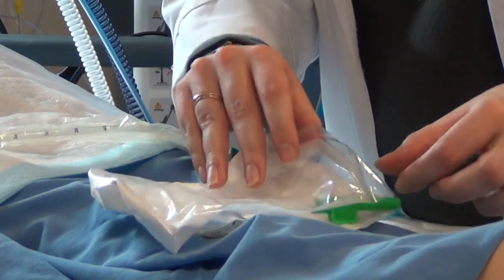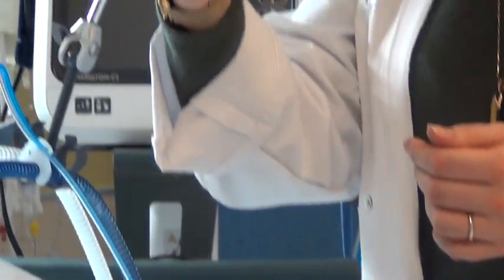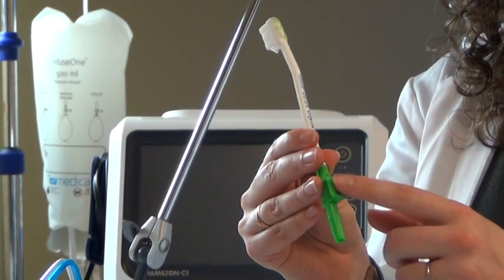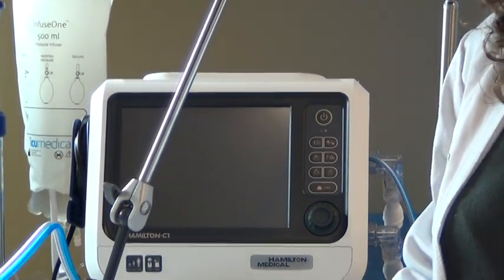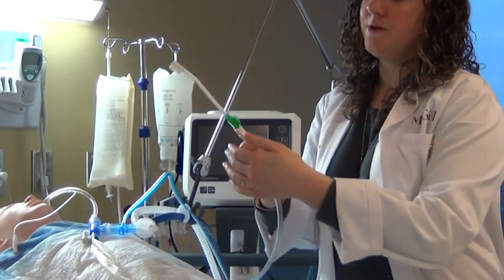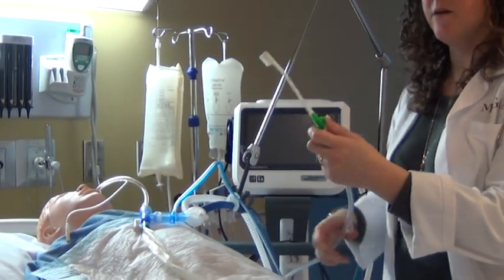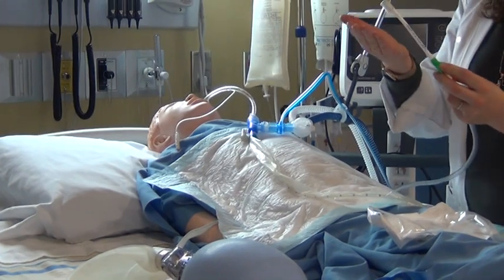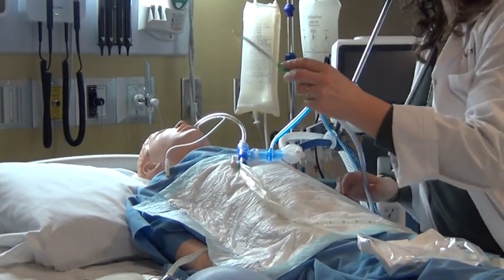And so for mouth care, you might have a device, just an actual simple toothbrush. The specific thing about this toothbrush is that there's a port here that we can actually block. So we can connect it to a suction catheter, and as we press on this hole, it will actually suction everything out. So as we go in the patient's mouth, putting whatever product that we need to put, usually chlorhexidine is what we use to clean our patients' mouths.